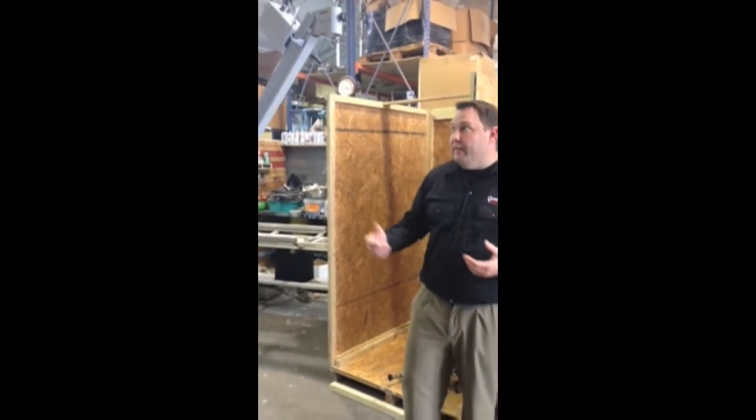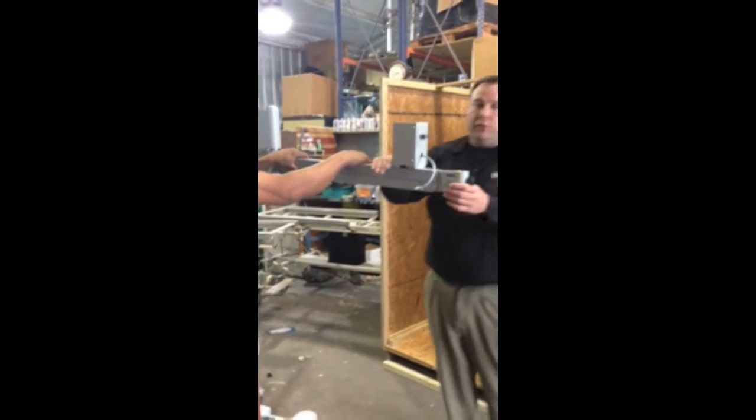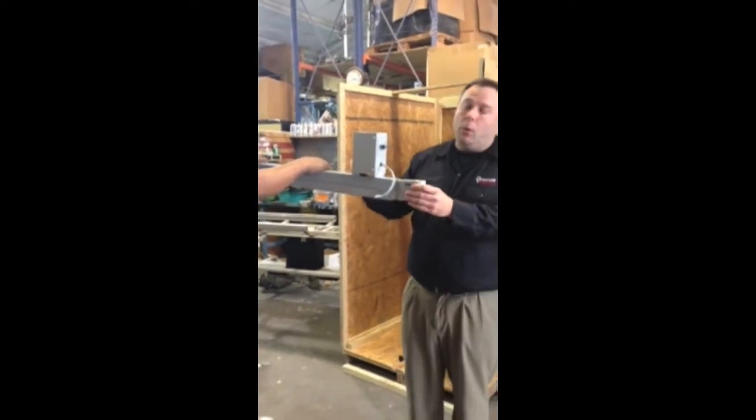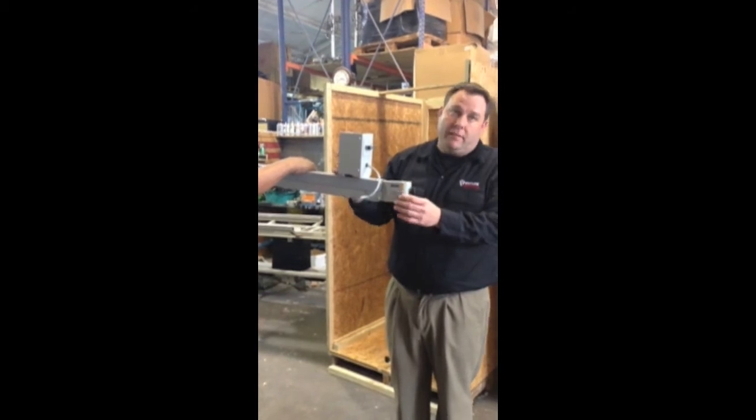We don't ship the microscope with the head assembly because it's too dangerous and it can get hurt too easily in shipping. So here's what you're going to need to do. With the help of a friend, if you could have someone help you, hold down the arm level and secure it — it's spring-loaded. It'll come up real quickly if it's not secured by someone else.